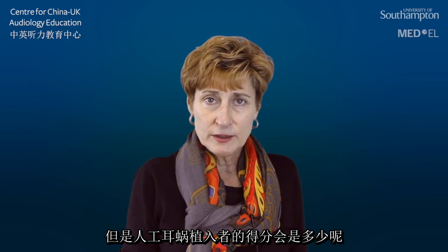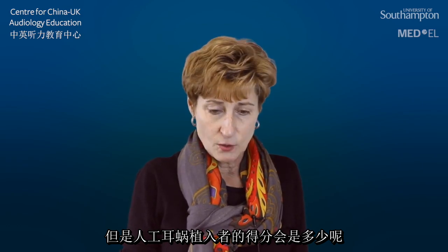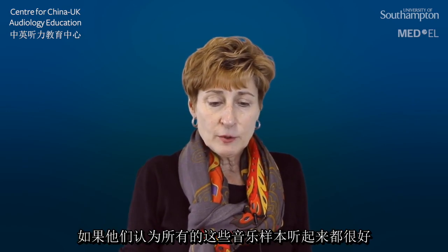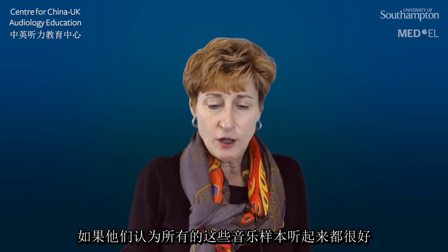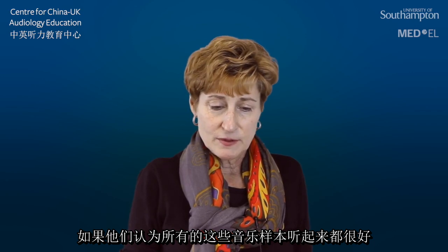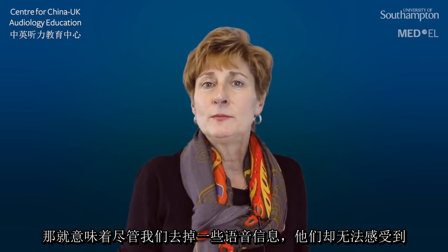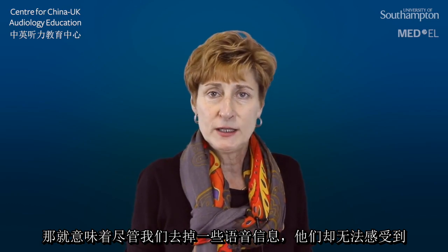But what do cochlear implant recipients score? What does their performance look like? If they rated all of these music samples as very good, then that would mean that as we take information away, they're not experiencing that loss of information.